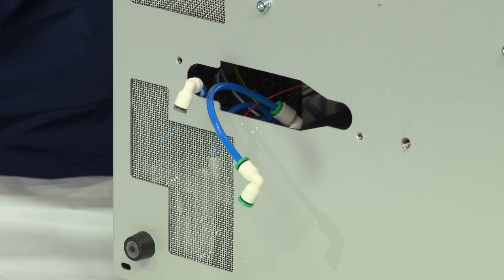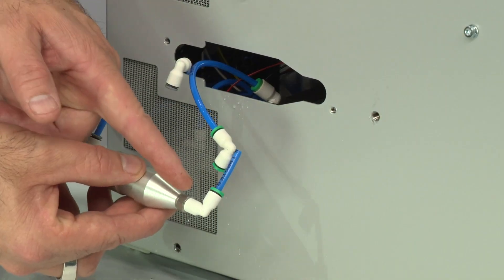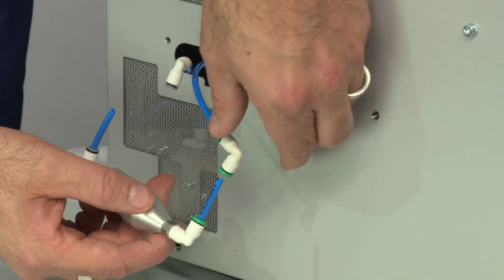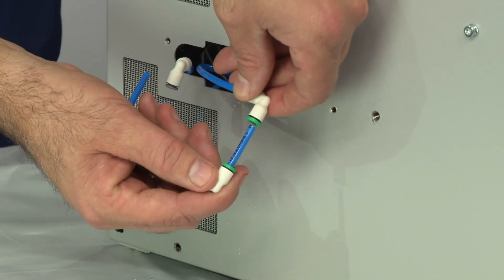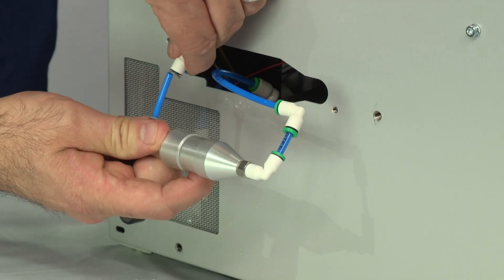Remove the water filter and replace it with a new one. Reconnect the tubes, making sure the ring colors match. Green to green on one side, gray to gray on the other side.